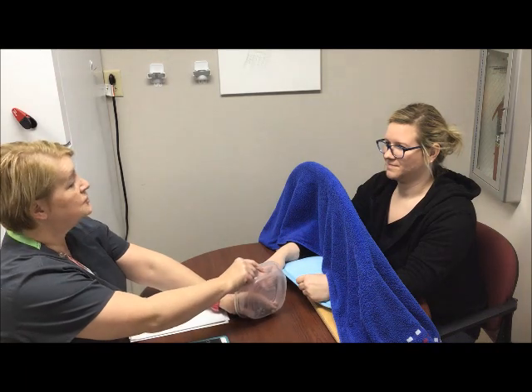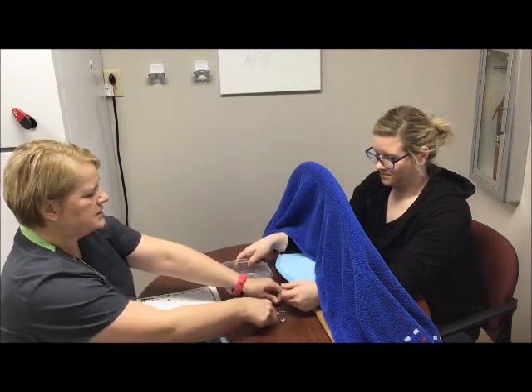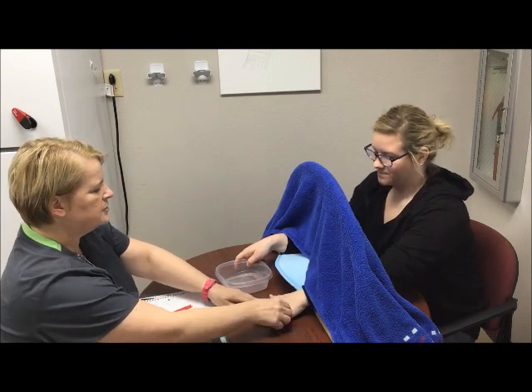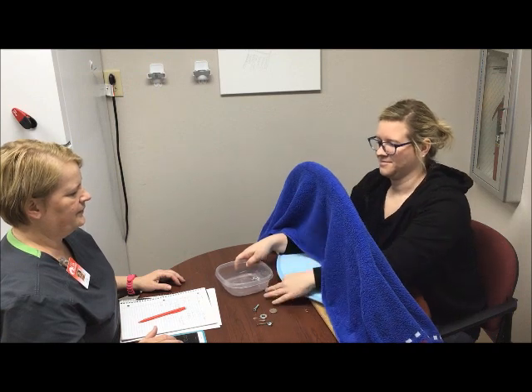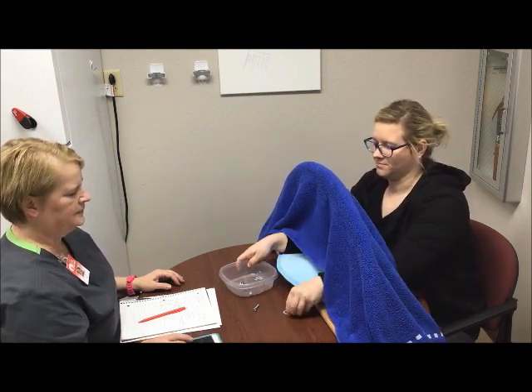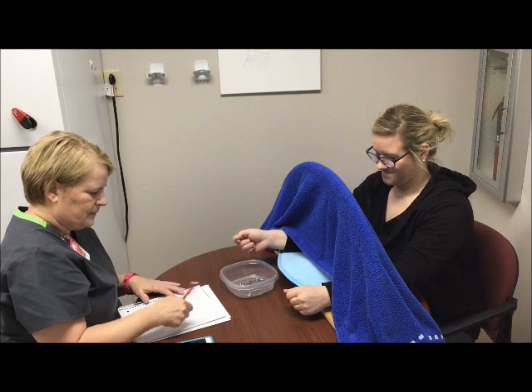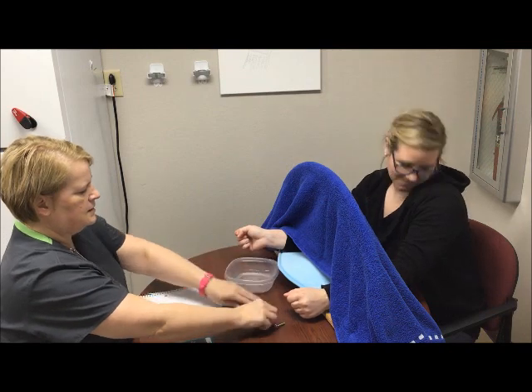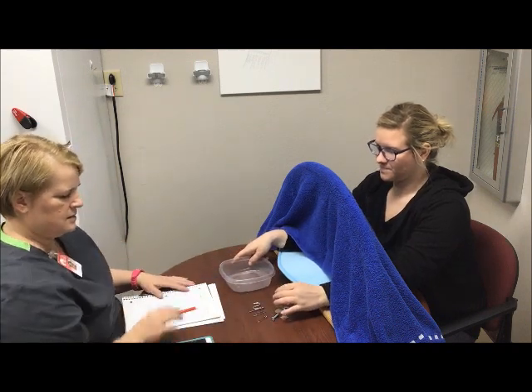Good. Okay, excellent. Now we're going to do the other hand. I'll have you hold the container with your right hand, and all of the items are going to be closer to your left hand. Can you reach? Are you comfortable being able to feel all that? If anything moves, I'll make sure it's within reach for you. Okay, ready? With your left hand, into the container — go.